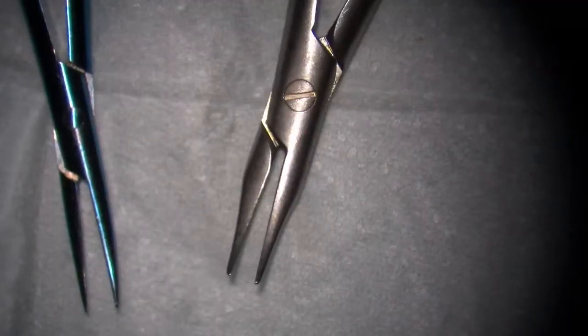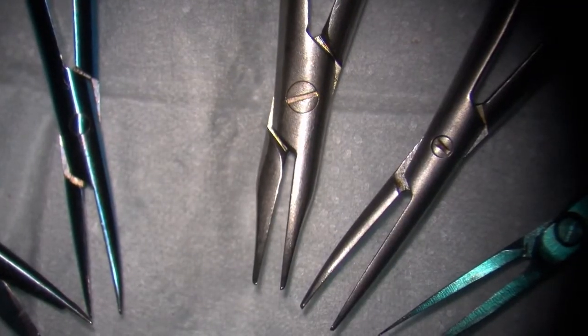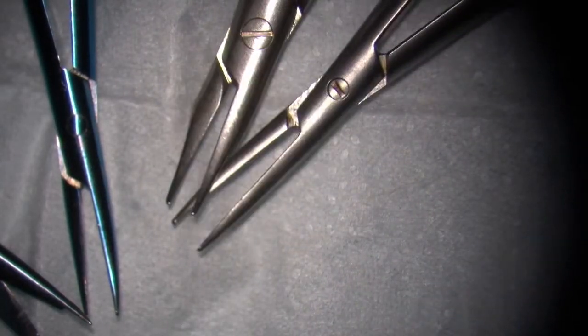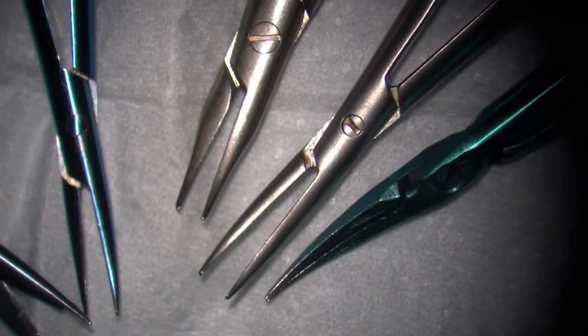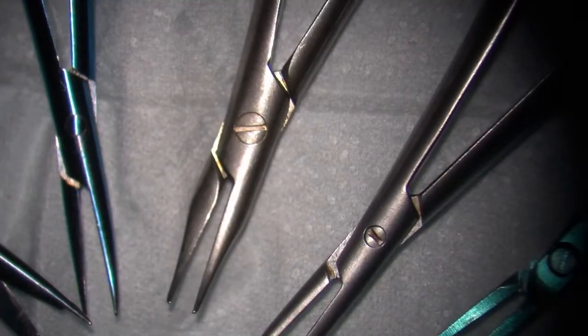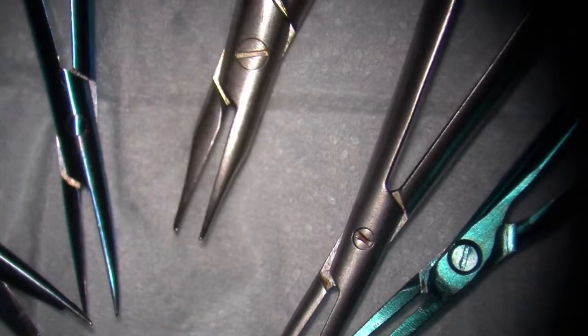And what other difference do you see? In terms of texture for the outside, or how you're holding it, I'm not sure if the color also has other indications, but I noticed that as well. These look to be a little longer than here. Definitely broader tips, a broader tip with the one in the middle. Yeah, the tip, good point. The tip is an important part. This tip is stronger, and this tip is thinner and more delicate. This instrument is designed for super microsurgery, to pick up like an 11-0 nylon needle. This stronger needle holder is for regular standard surgery. We pick up a 9-0 or 8-0. So if we pick up the big needle with this very fine instrument, it will damage the tip of the instrument.